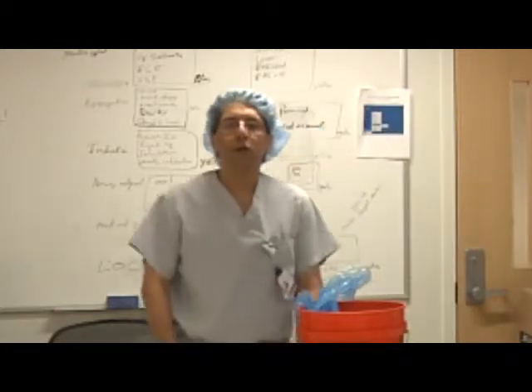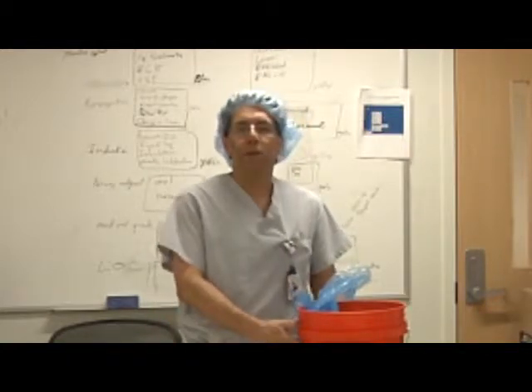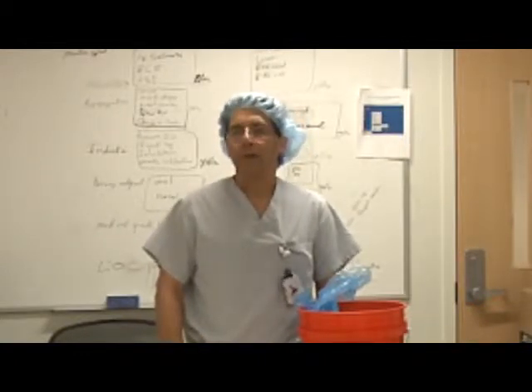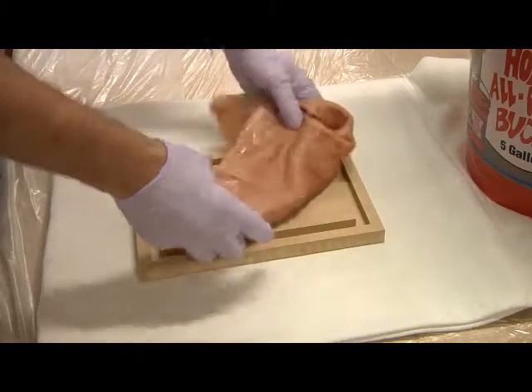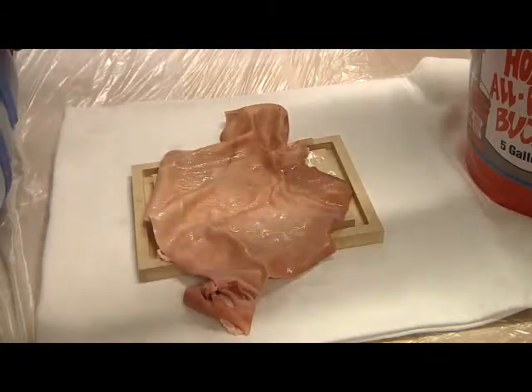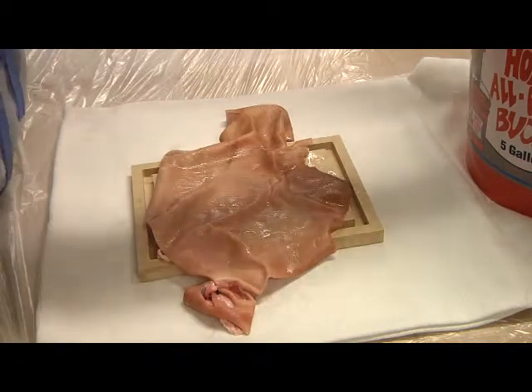In general, the tracheas will come to you frozen, often on dry ice. They'll be rock hard. It's nice to have a bucket filled with hot water to place the tracheas in and defrost them. You'll need to do this ahead of time. If you have access to hot water, you can usually do it within an hour of the workshop. So when we do the preparation, you'll need a piece of swine skin. Often they're cut in irregular sizes or too large for the preparation, and we will cut that down. And of course, one of the tracheas.